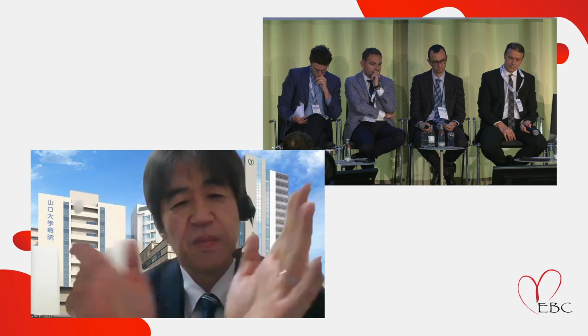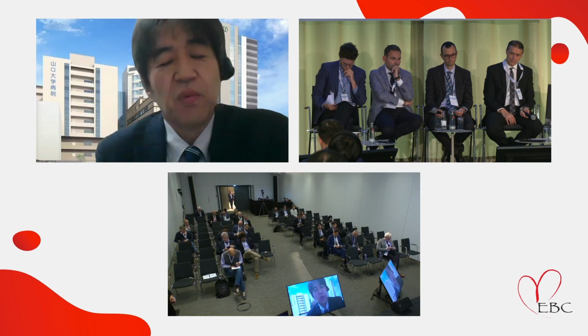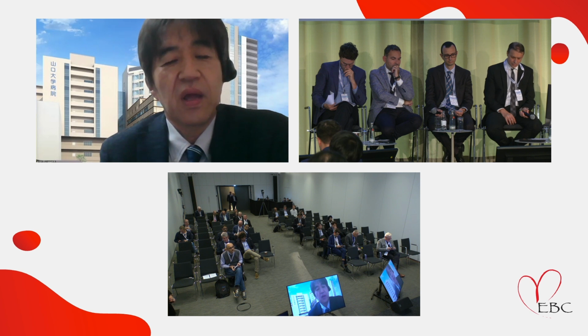So under fluoroscopy, it's very bizarre, so we cannot manipulate the guide wire accurately. So I think the bench test, including the cardiac motion, is very important, I think.